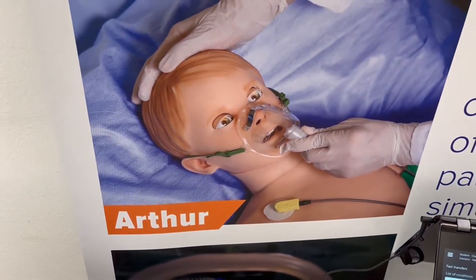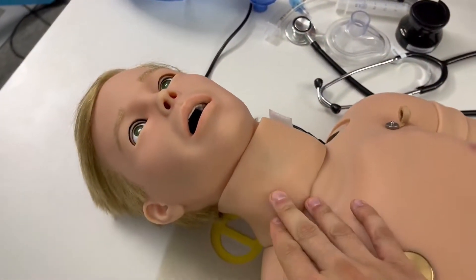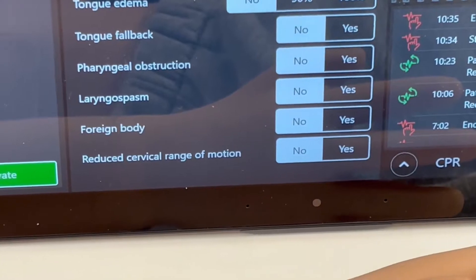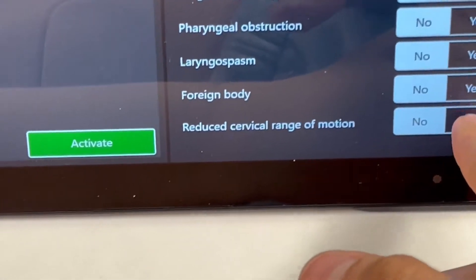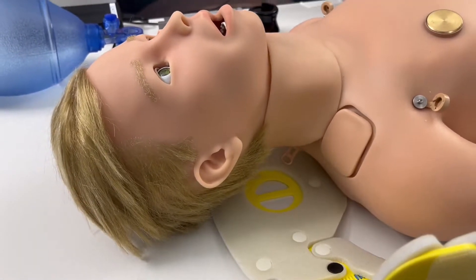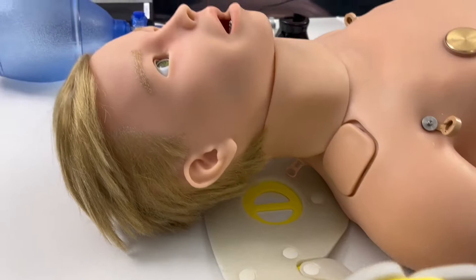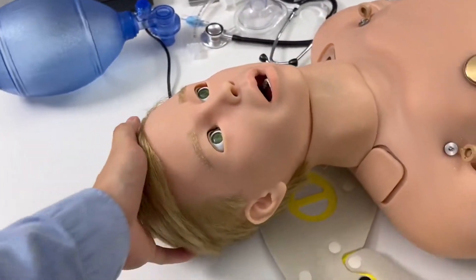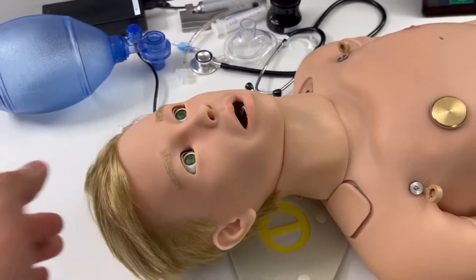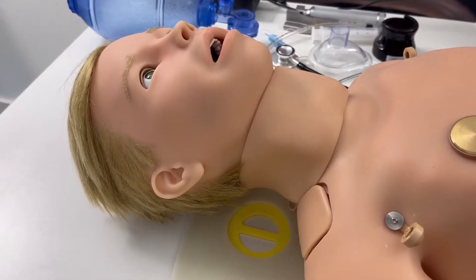While we're on the topic of the neck, one of the new features is the reduced cervical range of motion. I'm going to toggle that, and here you'll be able to see Arthur's neck stiffen up — it's become more difficult to move his head around. You'll be able to see it relax when I turn that feature off.